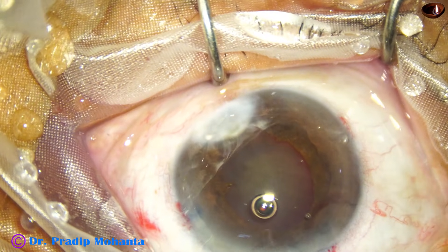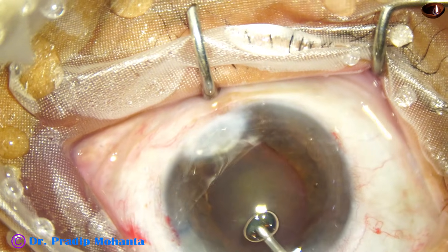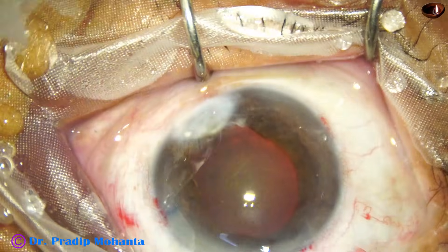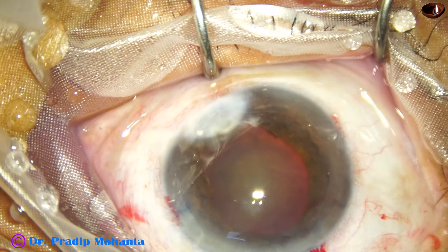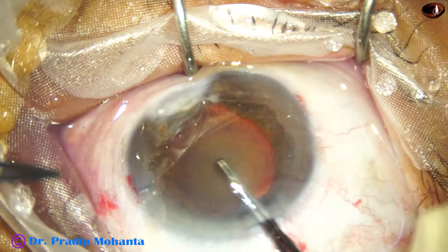So I ask for a long-bladed Vannas scissor and cut this. Now the pupil will dilate well and a pupil expansion device will not be required. See — after viscoelastic, the pupil has dilated quite well. Now I am going to do capsulorhexis.